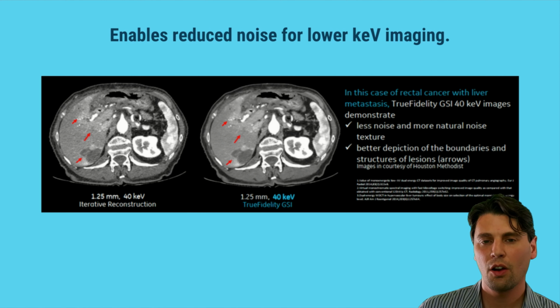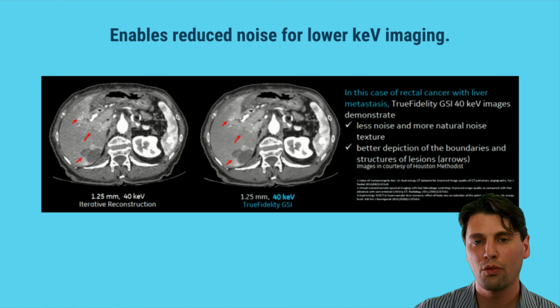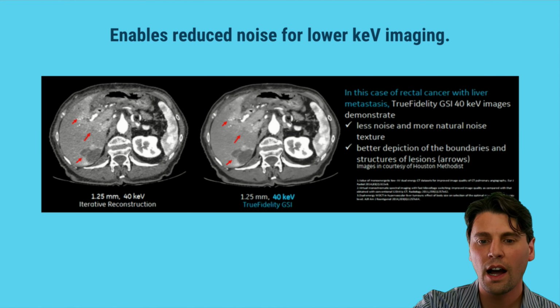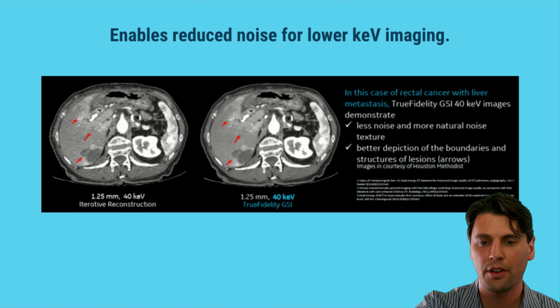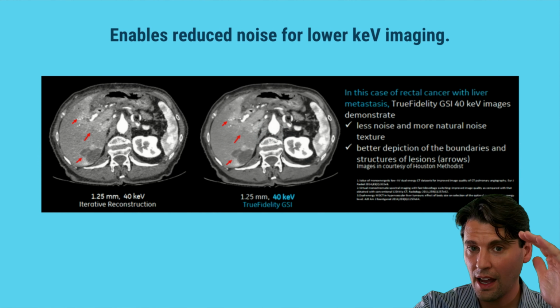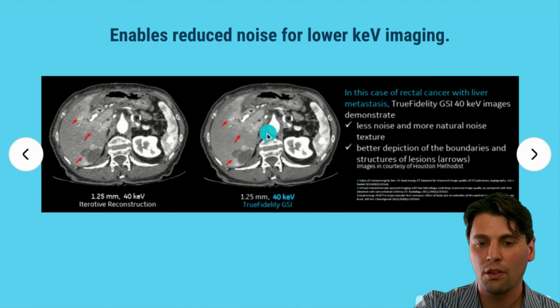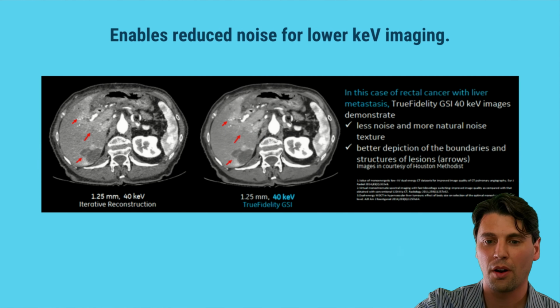And this scenario that I'm showing here is relatively thin slice images, so 1.25 thickness, and also reconstructed at 40 keV, so at the low end of that energy spectra. And you can see that for the iodine contrast, you're going to have improvement in the contrast such that you can see here the borders of the contrast are well differentiated after the denoising using these neural networks.